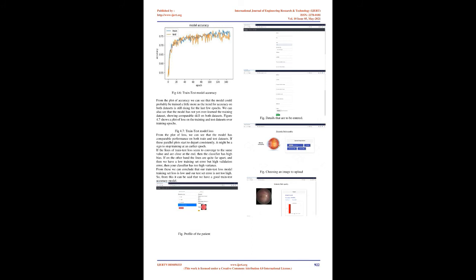There are 1151 rows and 20 columns in the dataset. After splitting the data into 2 parts, now we have 920 rows for train data, and for test data we have 231 rows. When we trained our train data for analysis of performance of different algorithms, this is the result we got.